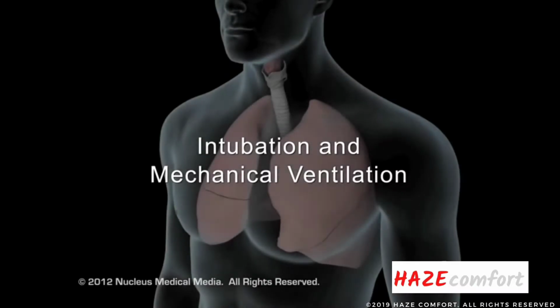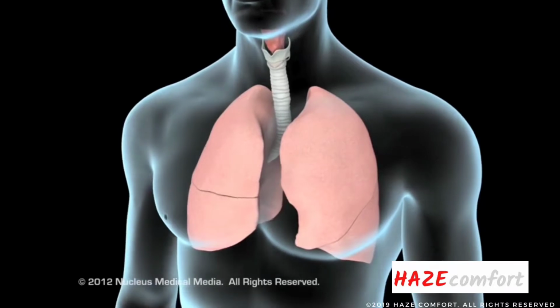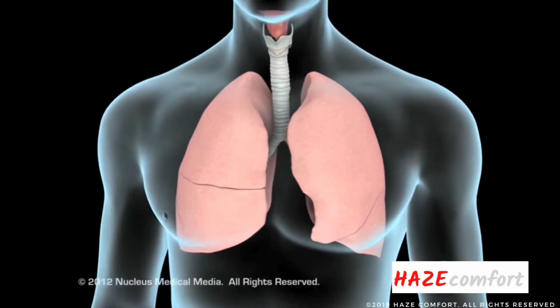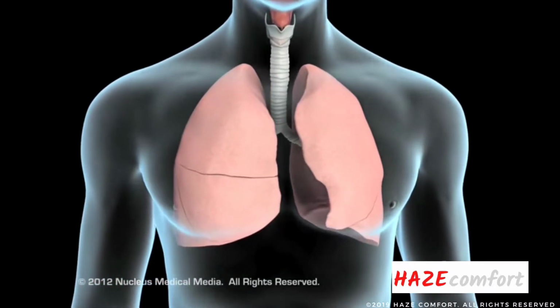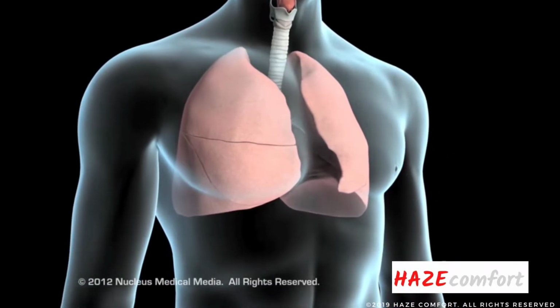Receive endotracheal intubation and mechanical ventilation if you are in an emergency situation involving severe respiratory problems, or if you are having general anesthesia during a surgical procedure.